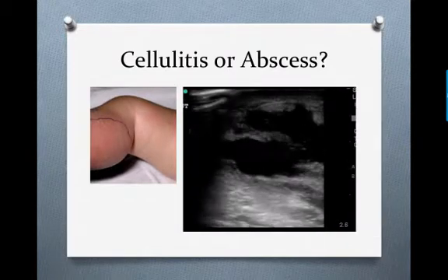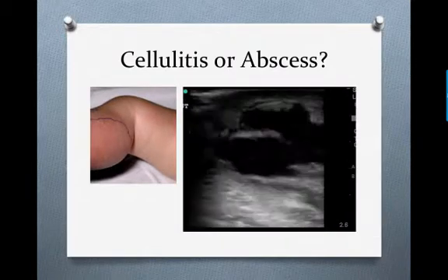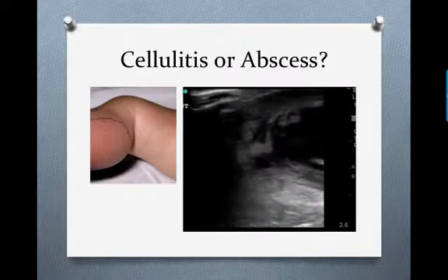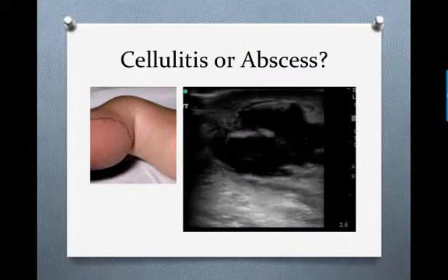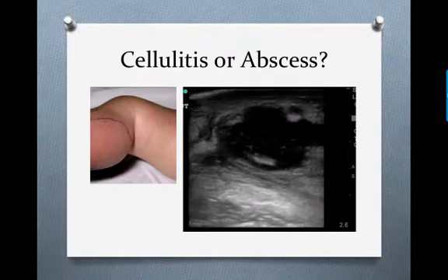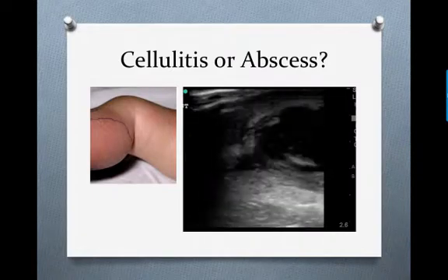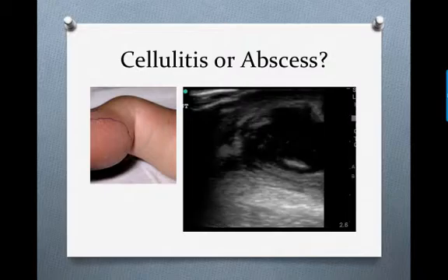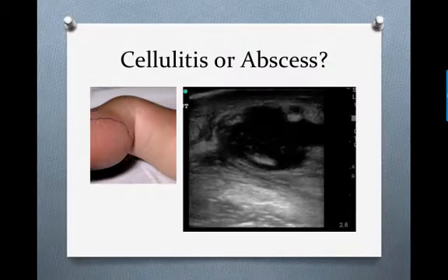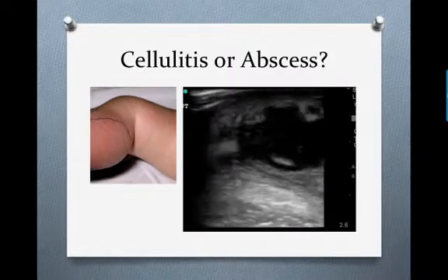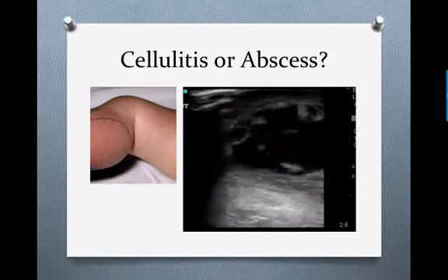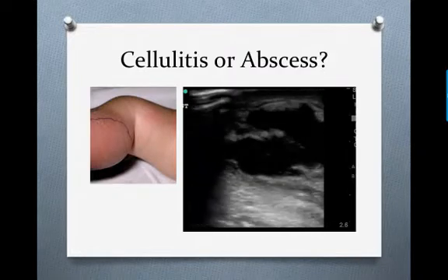Same patient, but with different ultrasound results here on the right. You can see a complex fluid collection with irregular borders — this is consistent with an abscess. This patient would require an incision and drainage. Ultrasound can help you locate the best place to make your incision so that you don't have to make multiple incisions and you have a higher first-time success rate when draining it.